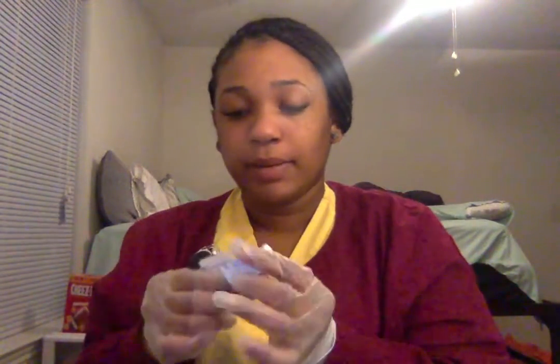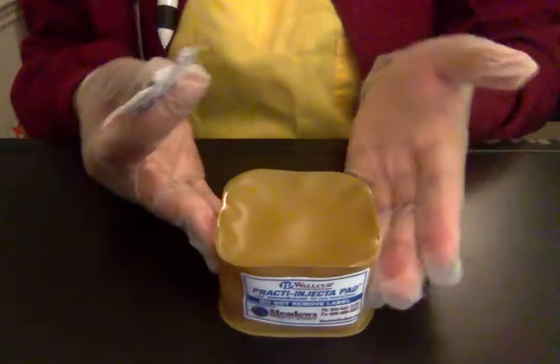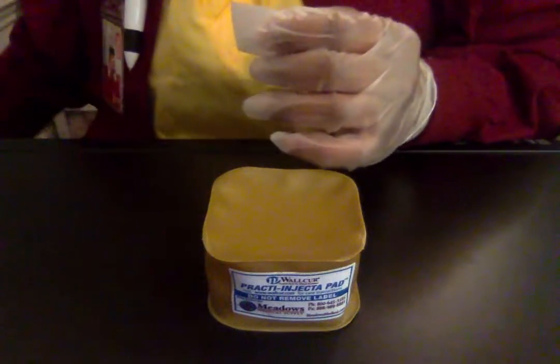So now that I have my hand hygiene done, I have my gloves on, so I'm going to go ahead and find that spot on my patient, and I have found that spot. Let's move this down so that you're able to see. So today this is going to be my patient. So I found that spot that I want to give that injection in.